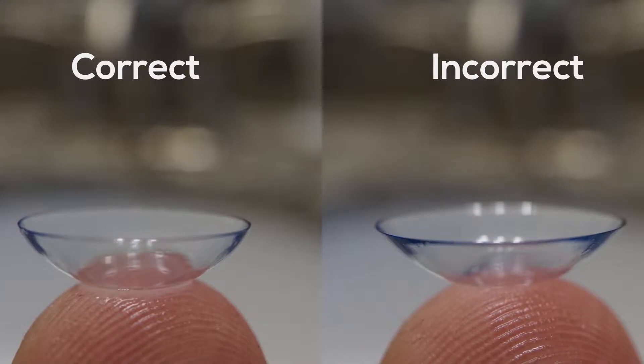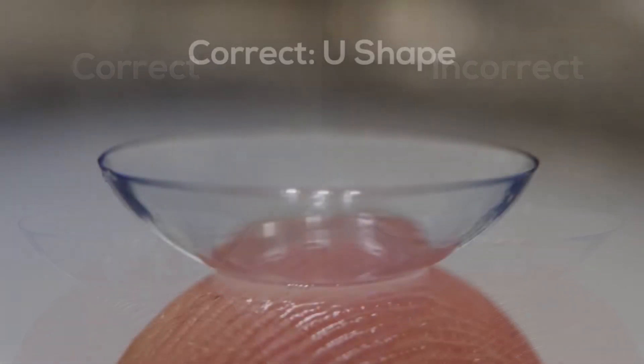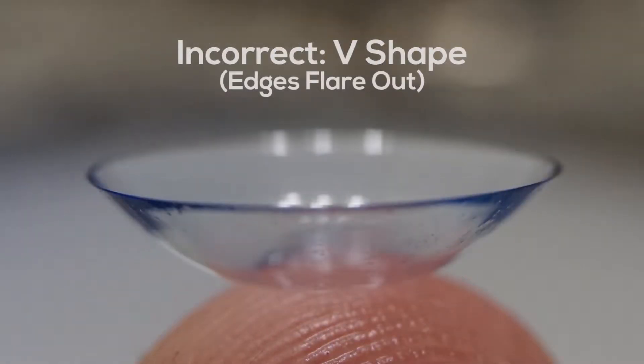Step 4: Check to make sure your contact lens isn't inside out by doing one of the following. Option A: Look for a U over a V shape. Place the contact lens on the tip of your finger and carefully assess the lens to make sure it makes a U shape. If it makes a V shape or flares out, it's inside out.